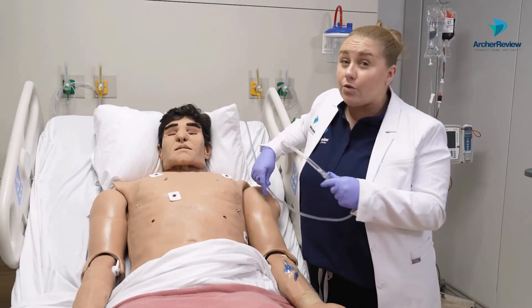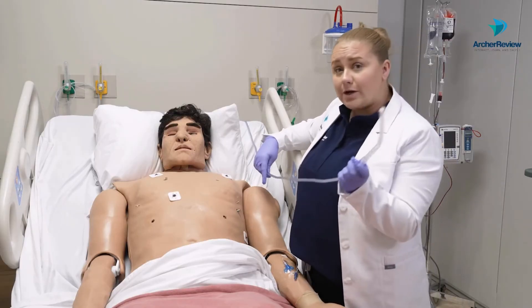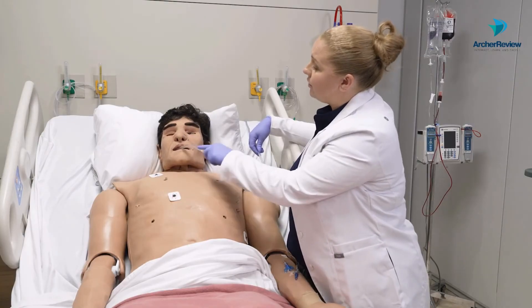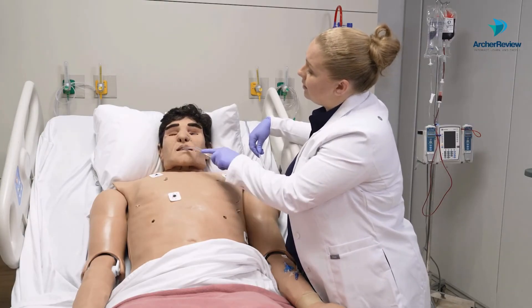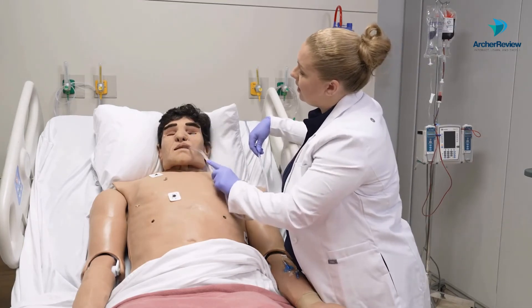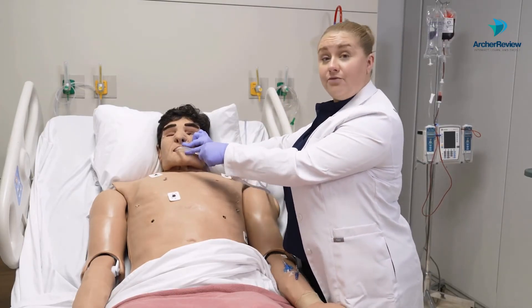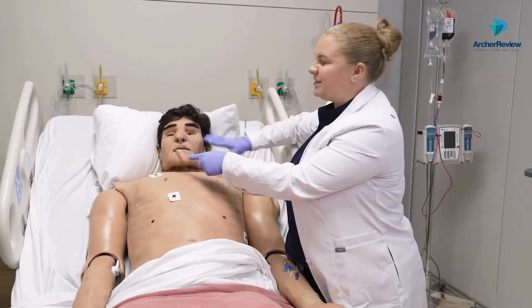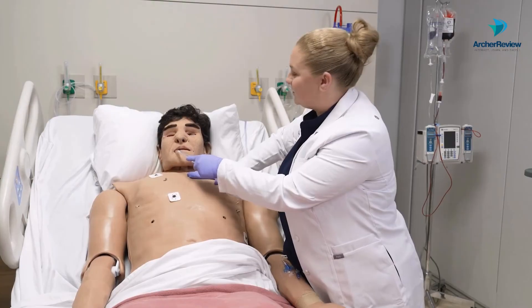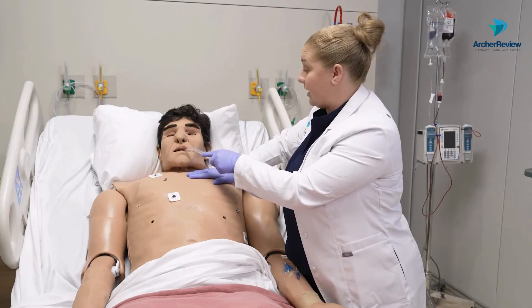I don't need to stick this all the way down their throat or anything. I'm cleaning out that oral cavity. So I'll take my yonker or argyle, place it in Mr. Smith's mouth, go over to his left cheek, under his tongue. Can you give me a big cough? If we have them seal their lips and give us a big cough, sometimes we can get some of that phlegm out. Sometimes I'll do some taps on their chest — a little manual chest PT — to help get that gunk out while I'm applying oral suctioning.